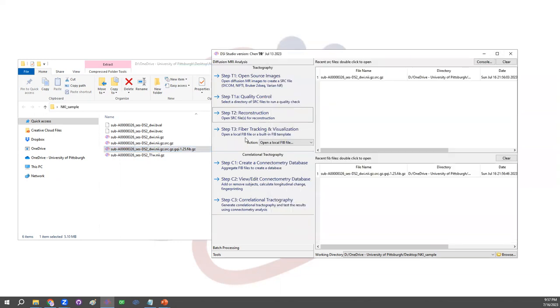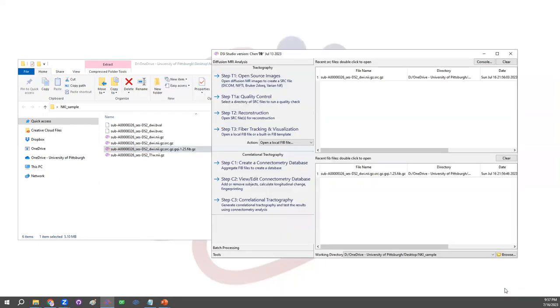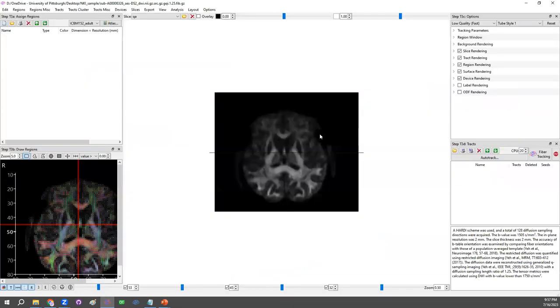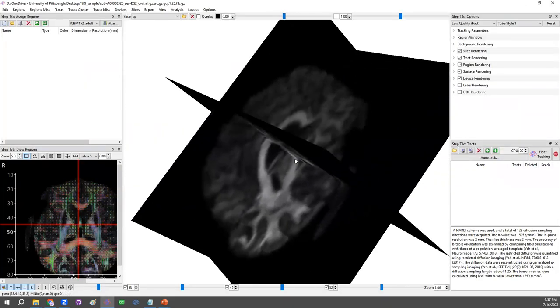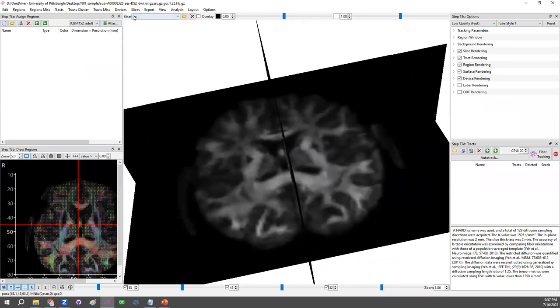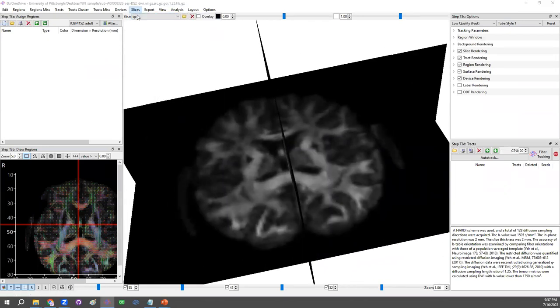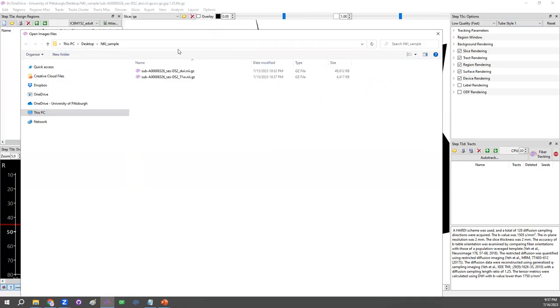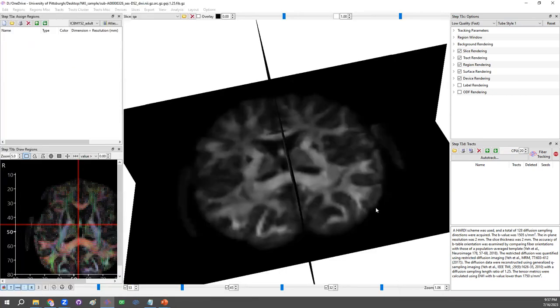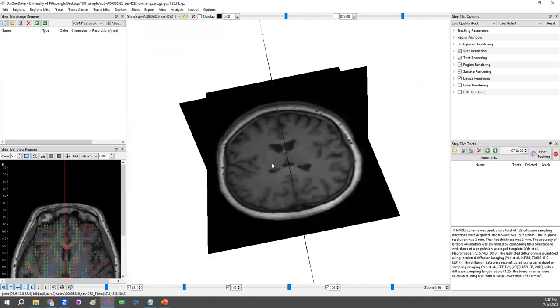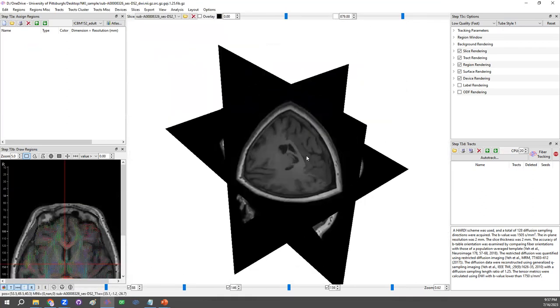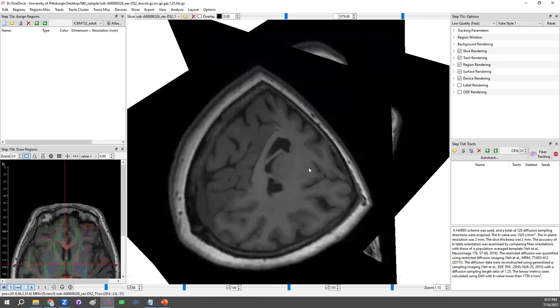Open this file, go to step T3 fiber tracking and visualization, and open this file. Now we are ready to do fiber tracking. In the middle, here's the 3D window showing the slices. And we could optionally load in the T1. So go to the slice menu, insert the T1 here. Bring the T1 image to help us get a better clear picture of the anatomy.